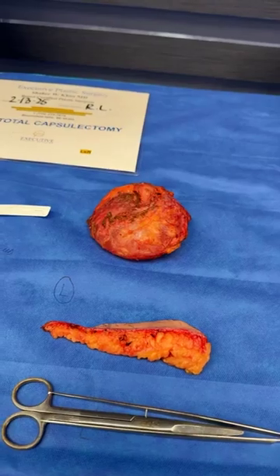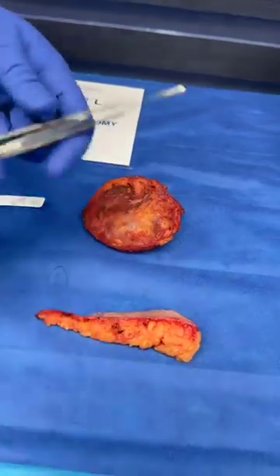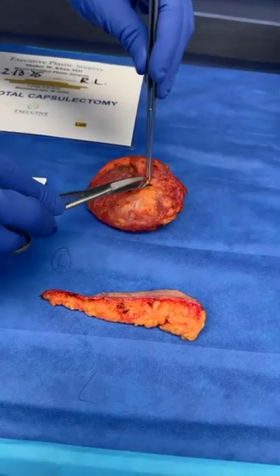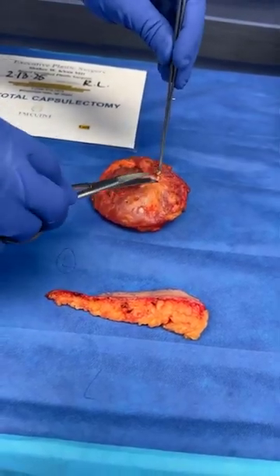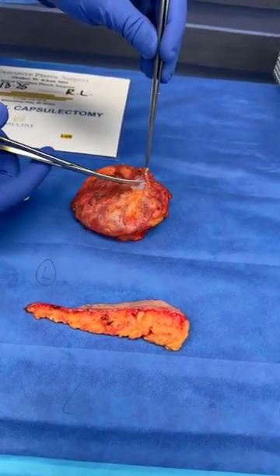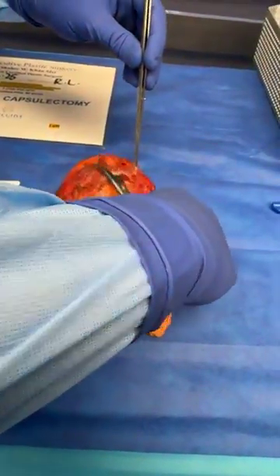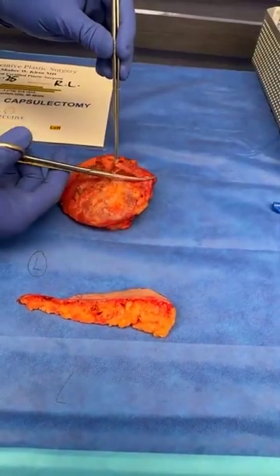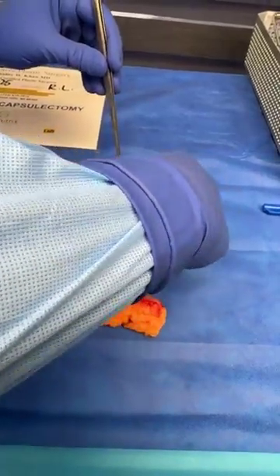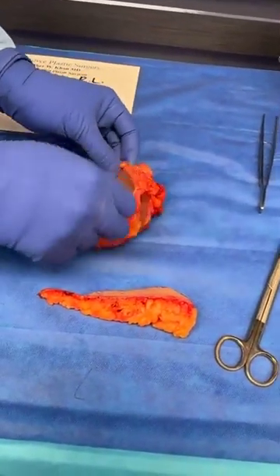again, it's important to return the implant so the patients know what was inside. Again, I removed and contoured the chest, and as I go in, you will see these are fairly new 2019 set of implants, silicone and not saline, and that's the purpose of this YouTube and Facebook Live.